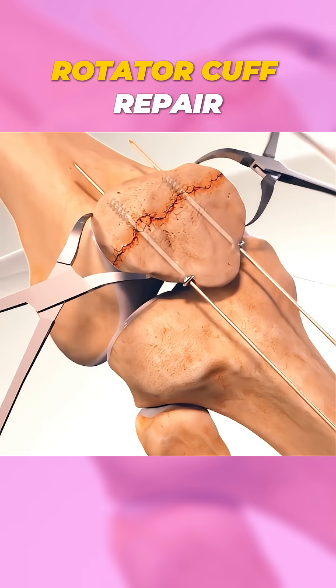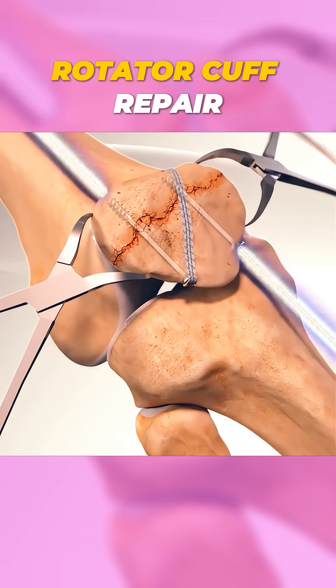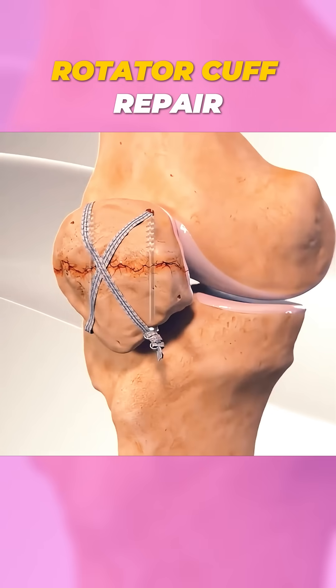Then strong wires, screws, or even small plates are used to hold the fragments together securely. This ensures the bone heals properly while maintaining knee mobility.